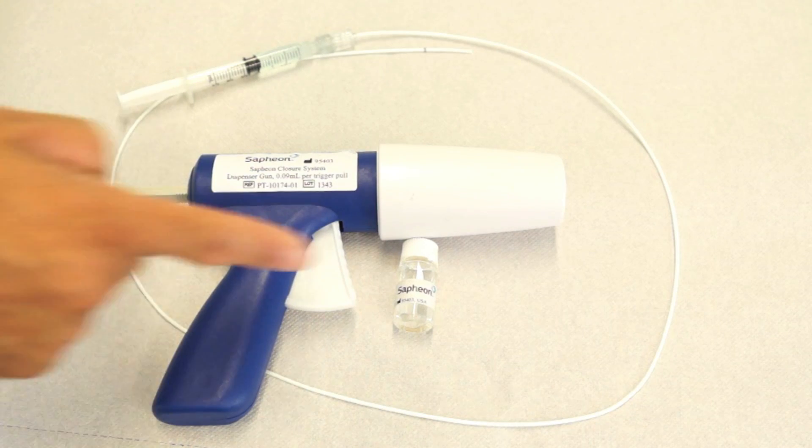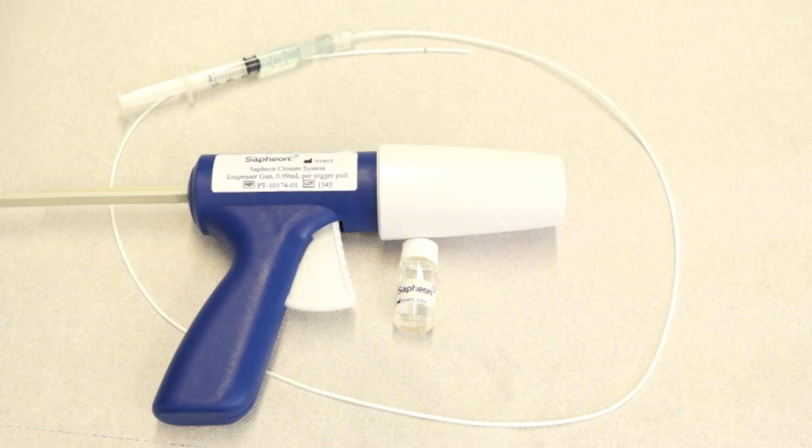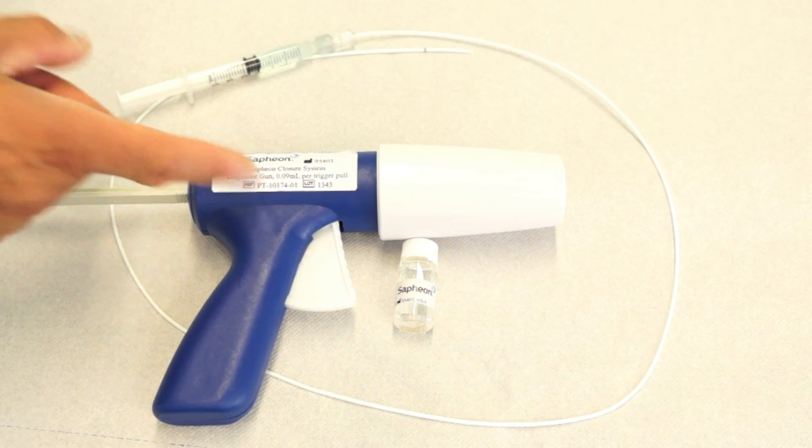I'm going to show you now the various elements of the procedure. Here is the vial of the superglue. It's drawn up into a syringe which is connected to a fine catheter which is introduced into the vein. This is the applicator gun which dispenses very precise amounts of glue.